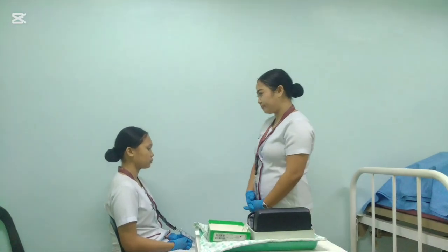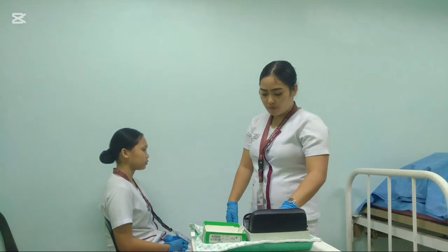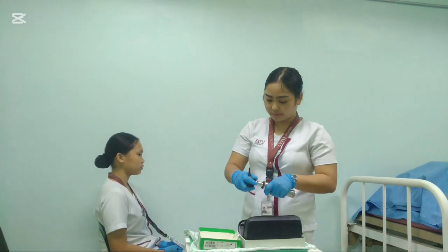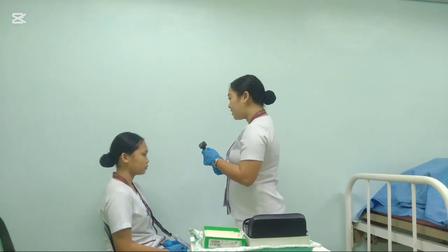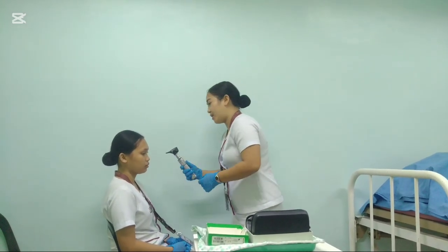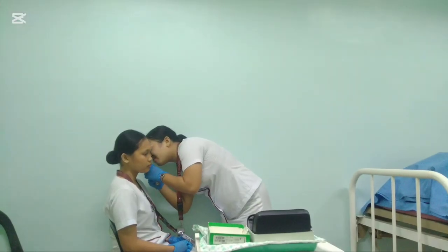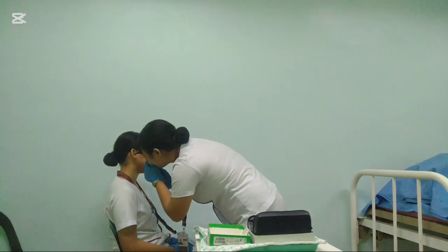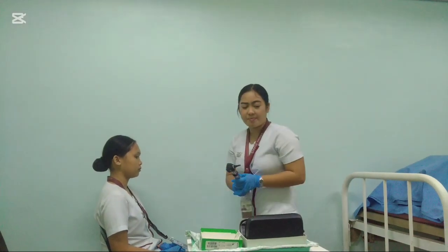Next, using an otoscope, I will inspect the internal ear of the patient to visualize the ear canal and tympanic membrane. Okay, the ear canal is clear and the tympanic membrane is intact with pearly gray color and positive light reflex.